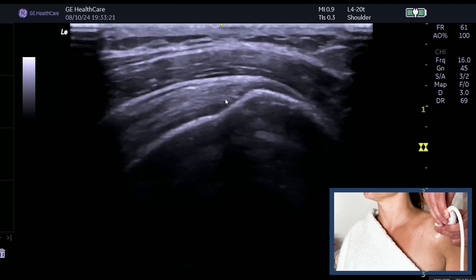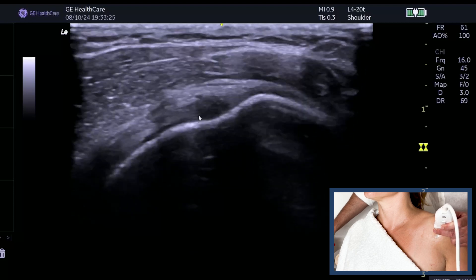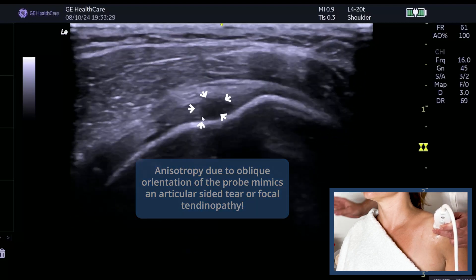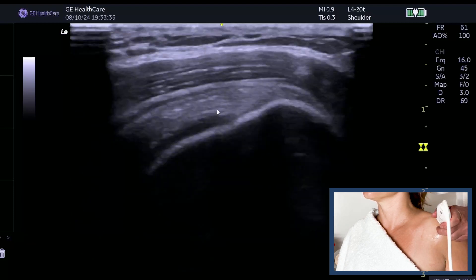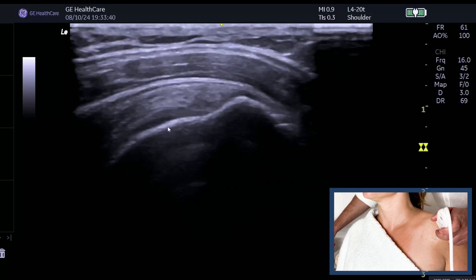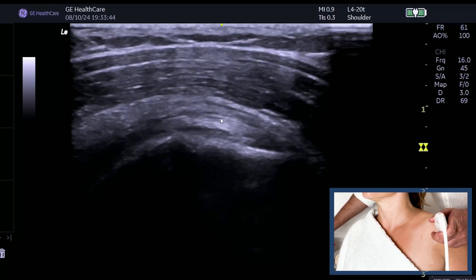Watch this — if I'm not truly long and I rotate, look at these dark patches that start to appear. You might think: is that an articular-sided tear? It's not — it's because you're oblique on the tendon. Make sure if you say you're long, you're long: confirm the bone is bright, you can see that parallel band of cartilage, and as you push forward you're on a nice long section of biceps.